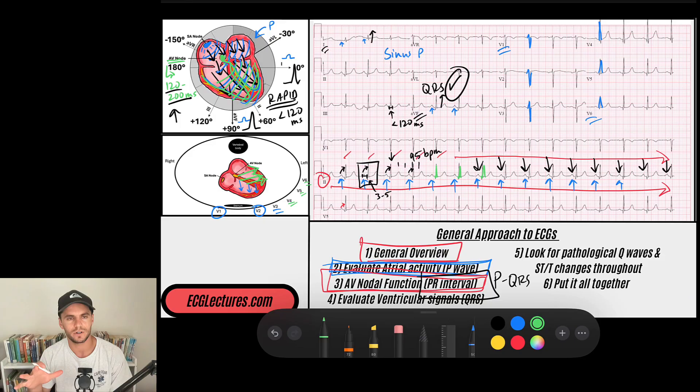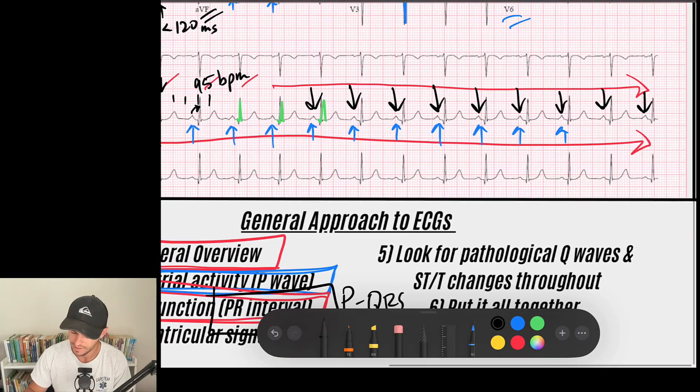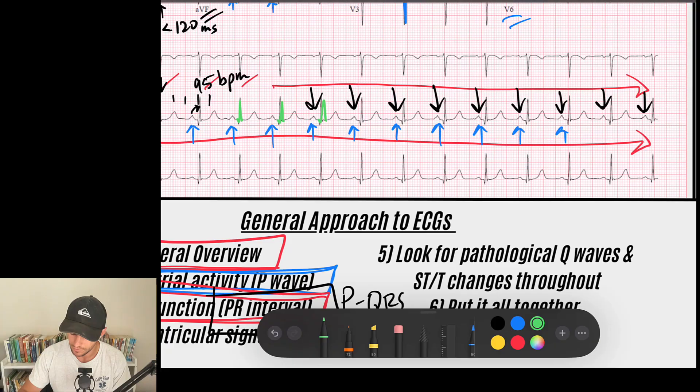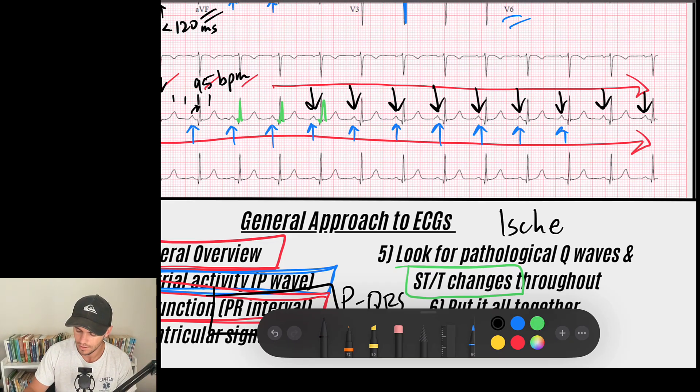Now we're done with our atrial depolarization, AV nodal conduction, ventricular depolarization. The next thing is ventricular repolarization. Remember, repolarization is essentially getting those cardiac cells back to their state where they can depolarize again. And so the way you look at that is you look at the ST segment. So if I zoom in at step number five, you're going to see, look for ST or T wave changes. So we're going to evaluate repolarization as well as we're going to also kind of call this our ischemia phase.